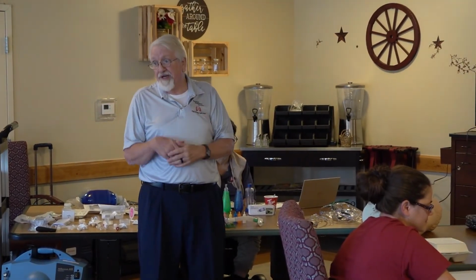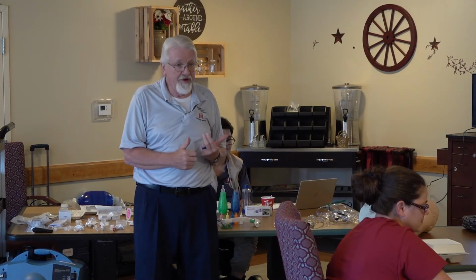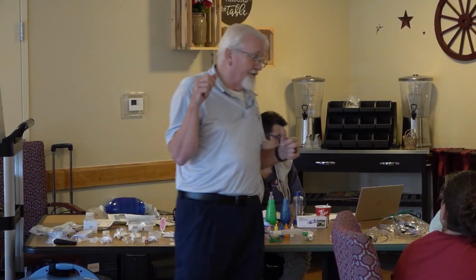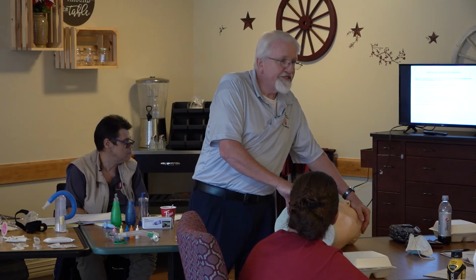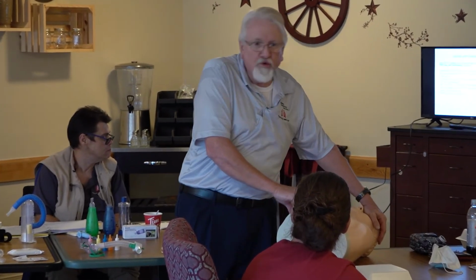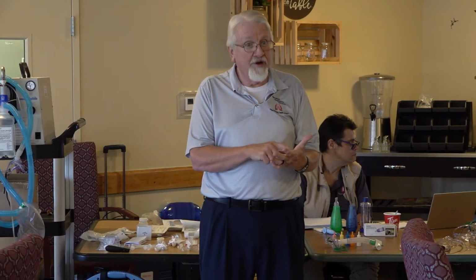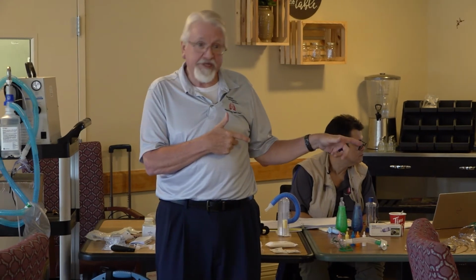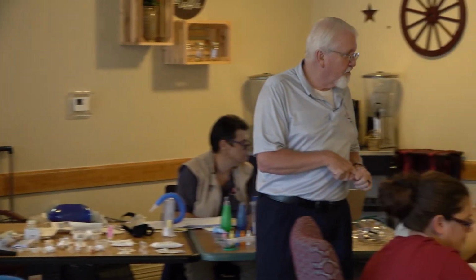So now we're going to get ready for suctioning. Back to the order sets. Suctioning should always be written PRN. Some doctors are going to write you the order for suction Q2. Okay, I get it. I'll explain why they do that. The doctor comes in to see Bob once a week. He's in there for 2 minutes. Every time he's in there, Bob's hacking and gagging and choking and all that stuff. So the doctor says, they're not suctioning my man. I'll take care of that. I'm going to write the order for suction Q2. So now the doctor's thinking he'll be taken care of.